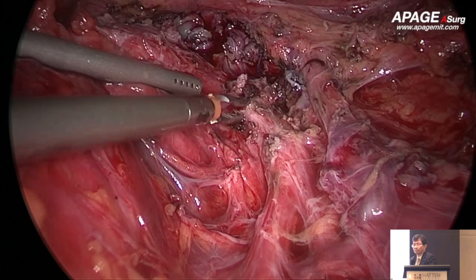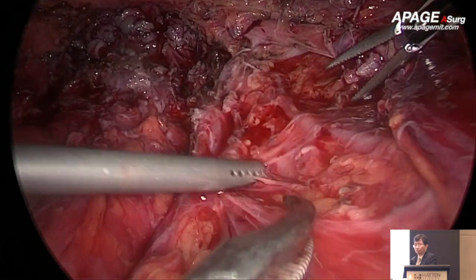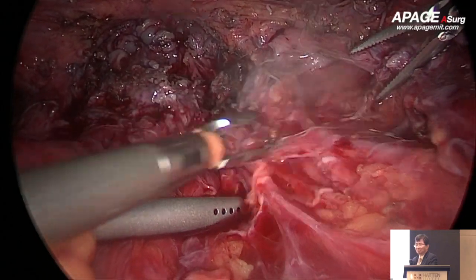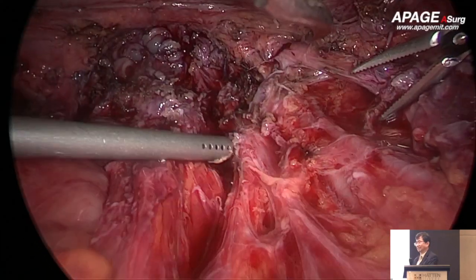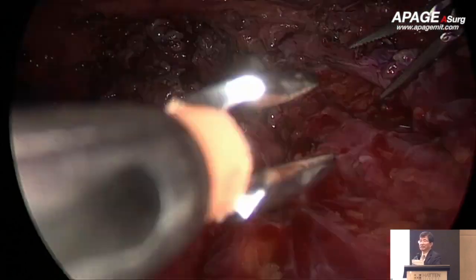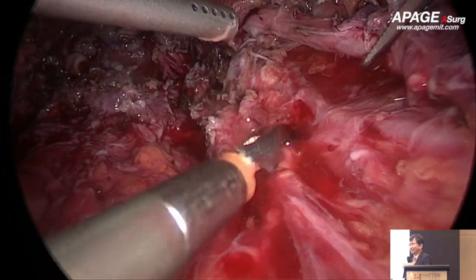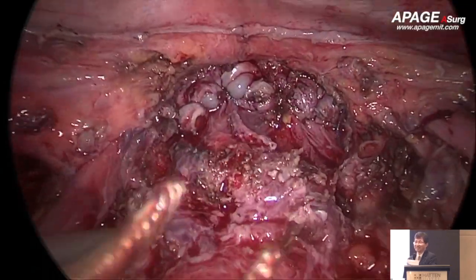Some doctors, if it's cervical cancer, don't put in any uterine manipulator, just the vaginal tube, and they use traction, just like open laparotomy, and then dissect out. What is your opinion about this? Yes, they say if it's a cancer, they don't put in the manipulator at all. That is the approach proposed by Masaki Endo, and also Kanoi, his student. That is the so-called no see, no touch method.